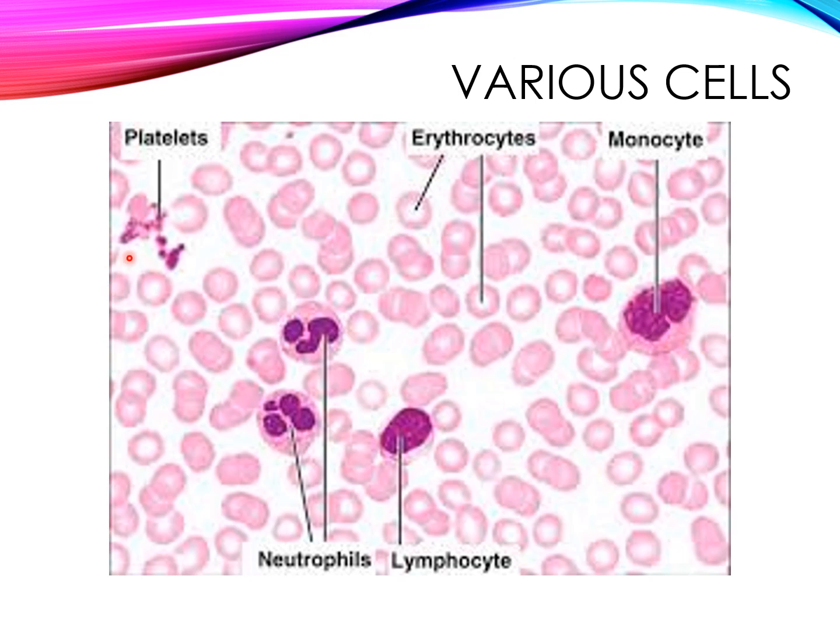And then over here we have some platelets or thrombocytes, which look like they're kind of clumped together. This is a single platelet up here, this little tiny purple dot, and this is a little clump of platelets that are together. So just start trying to be able to identify the difference between the platelets, the red blood cells, and the white blood cells.